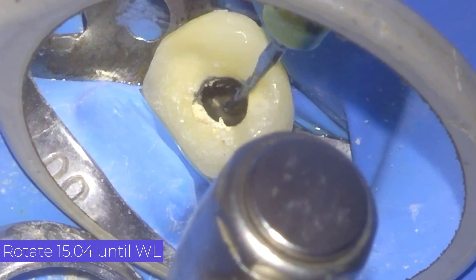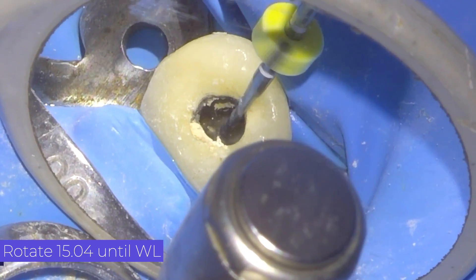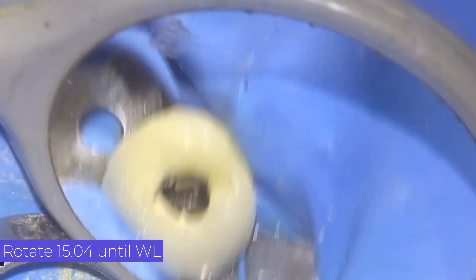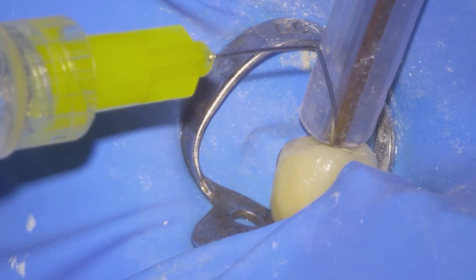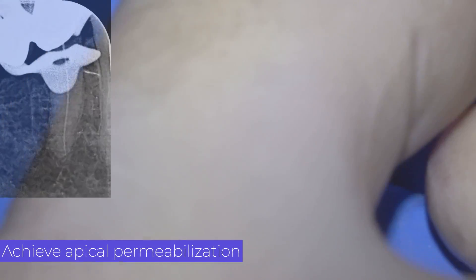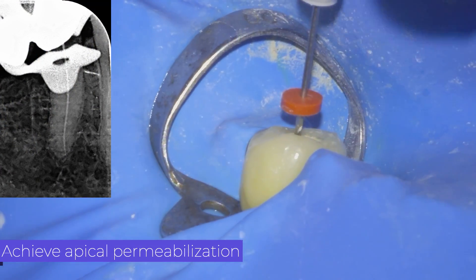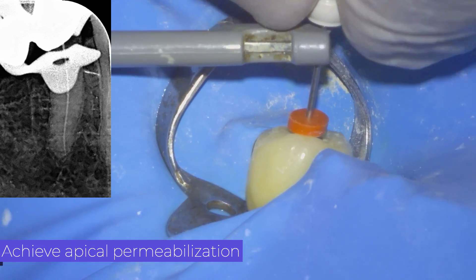As we see that the 15K file has a good glide path, we decided to use a 15 Rotate file with 4% taper. After each rotary file we irrigate with sodium hypochlorite and perform patency.